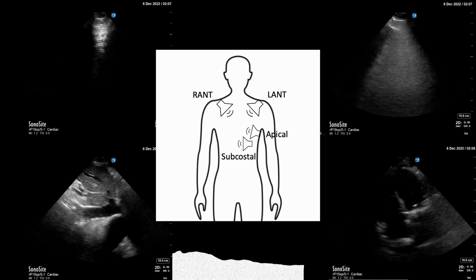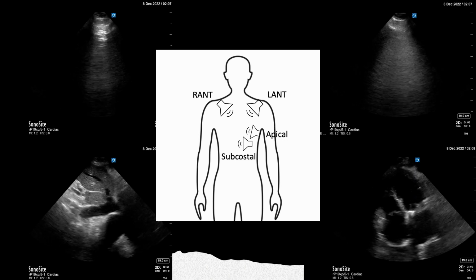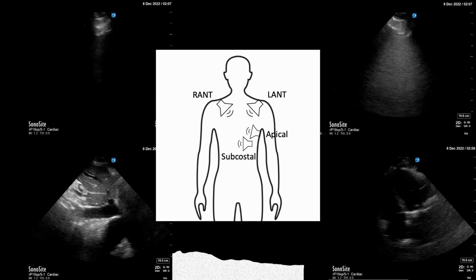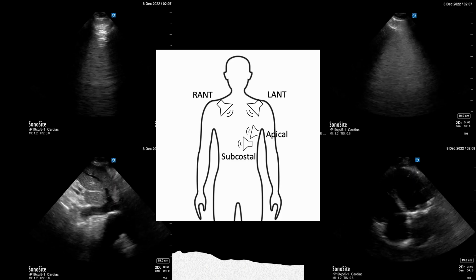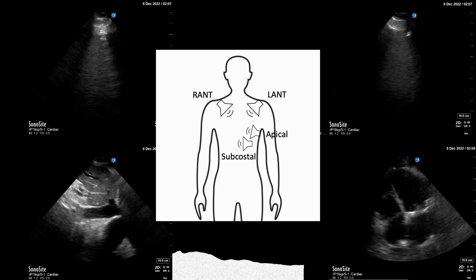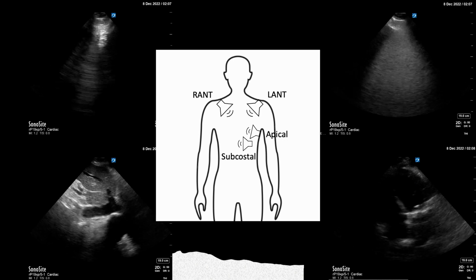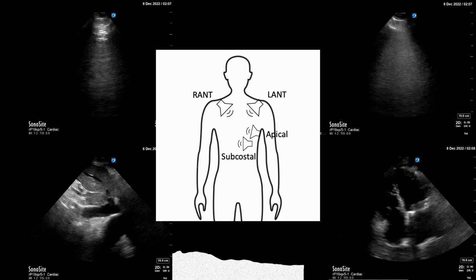So now putting it all together, I can see that I've got bilateral, snowy looking lungs. And this is also known, when you have more than 3 B lines, as interstitial alveolar syndrome. And there's really only 3 causes for it, and it's to do with consolidation. So you've either got fluid in the lung, you've got pus in the lung, so it's pneumonia, or you've got lung collapse, so lung on lung essentially. And part of that lung on lung is whether they've got interstitial lung disease as well, which can also give you that picture.